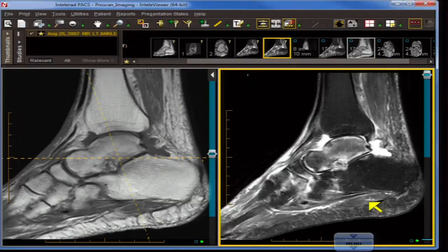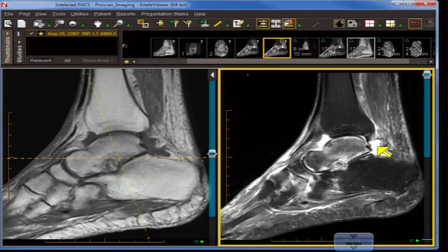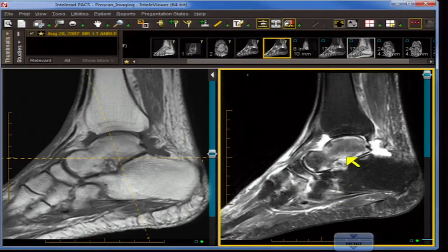Inflammatory arthritis such as RA is not a typical appearance here. RA usually shows edema in the hands and feet more in the carpal and tarsal bones adjacent to the PIP joints, and you'd expect secondary findings like more robust synovitis or soft tissue changes. There really isn't any fuzzy gray material in the effusion. In arthritis the high signal should be next to the joint, but it also shouldn't be away from the joint — if there's no joint causing inflammation, why would it be inflamed there?